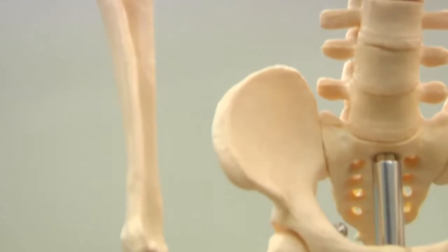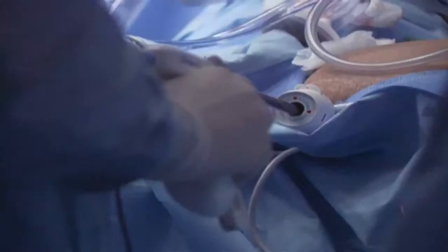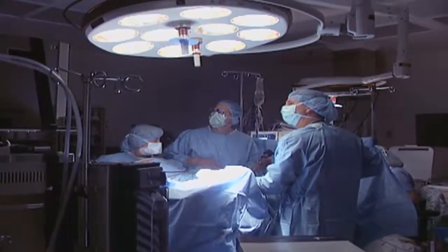The pain generally comes from either a malformed bone or a small tear. Guided by a small camera and using arthroscopic tools, surgeons fix the problem and get their patients back up and running.